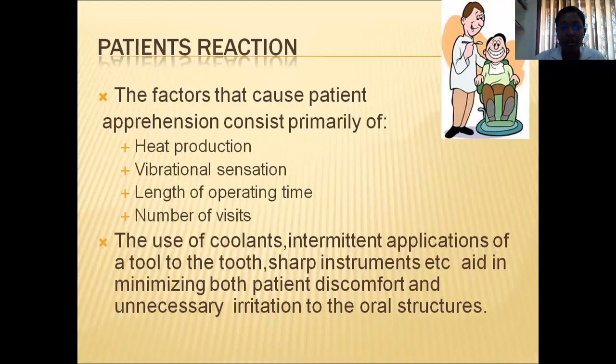Factors that cause tension or apprehension on the part of the patient are heat production, vibration sensation, length of the operation time, and number of visits.